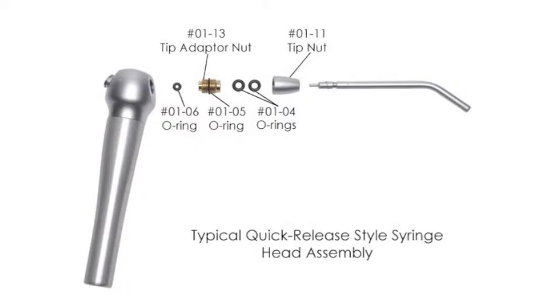The components in the quick release style syringe assembly consist of a tip nut, two syringe tip O-rings which hold the syringe tip in place, a skinny adapter nut O-ring which seals the adapter nut to the head of the syringe, and a small adapter nut O-ring which keeps the air and the water from mixing.